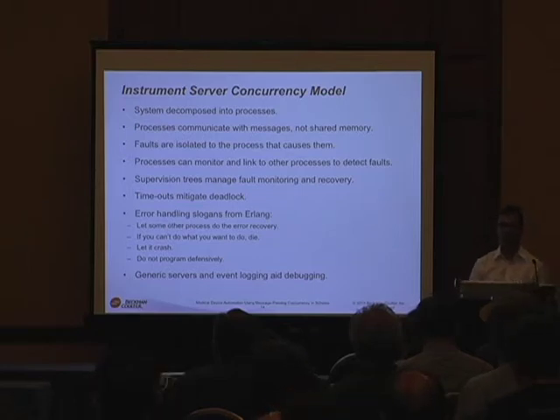One of the most important things was, since we are talking to hardware, hardware is going to fail. Sensors might fail, motors might stop moving, bad things can happen, and you don't want it to be a, oh my God, something bad happened, you can't react to it. You just built this in. This is supposed to be designed in, you want to be able to handle stuff like this.